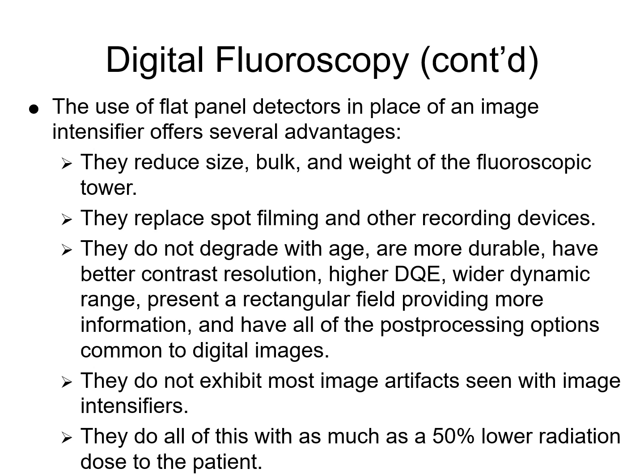The image intensifier had to have a lot of accessory equipment tethered to it before the invention of the CCD, like a spot filming device, a cinematic camera with a film spool, all those types of things, a beam splitting device. You can see those in chapter 25. Those are basically obsolete now. The CCD did all of that, and now the flat panel detector does all that.